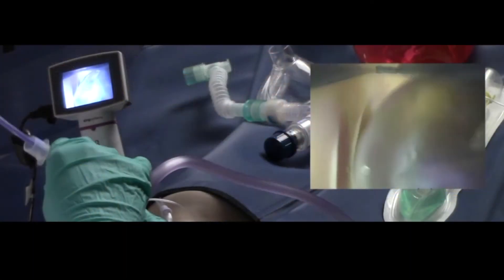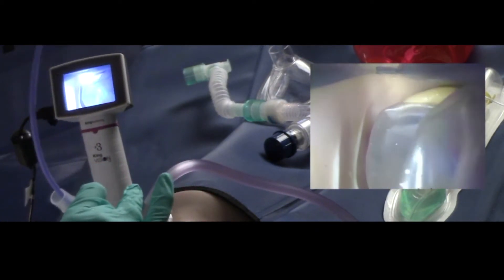If you don't see the epiglottis, back up. If you see cricoid rings, back up because you're too deep. But let's say you have the view, you have the epiglottis in position, you're not too deep, but the tube is coming off to the right of the vocal cords, or hanging on the arytenoid cartilage. There are a couple of things you can do. Number one, rotate the tube around — grab the distal tip of the ET tube and rotate it around in front of your camera. That dramatic movement will rotate the angle of the tip around the arytenoid cartilage and hopefully give you a better approach through the cords. That's not going to work if your bevel is hung on the arytenoids, so before you rotate, back up a little bit, rotate, then re-engage.